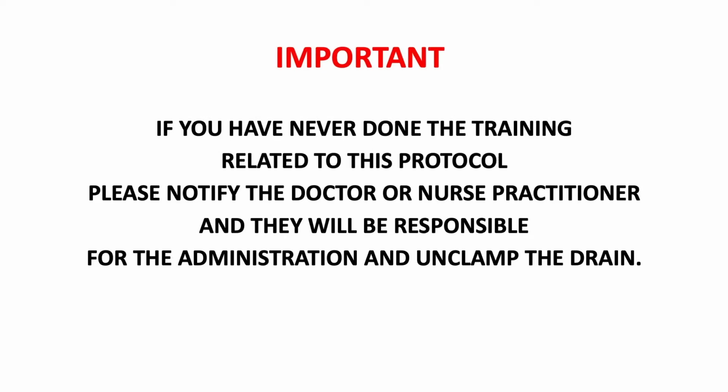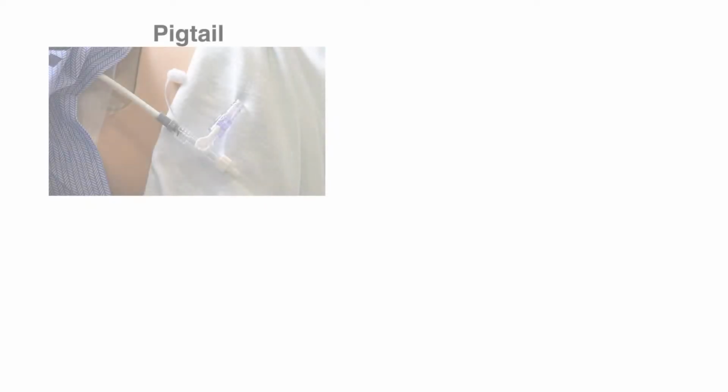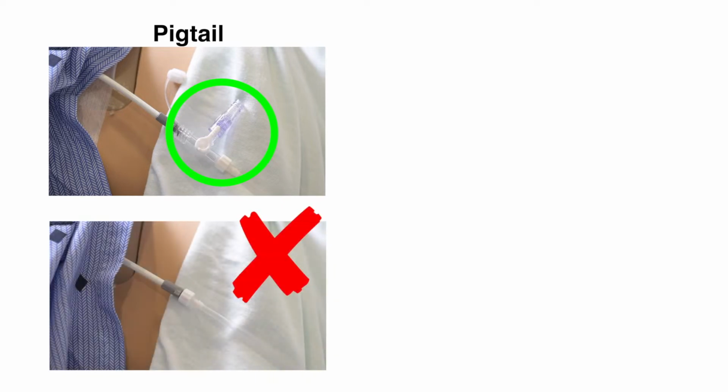A nurse can administer Alteplase and dornase in the pleural space only if the training with an educator was completed. If no nurse with training is available, the doctor or nurse practitioner will have to do the administration. Before starting, check that there is a three-way connector with a needle-free connector installed on the drain. The doctor or nurse practitioner must install a three-way connector to the pigtail drain.